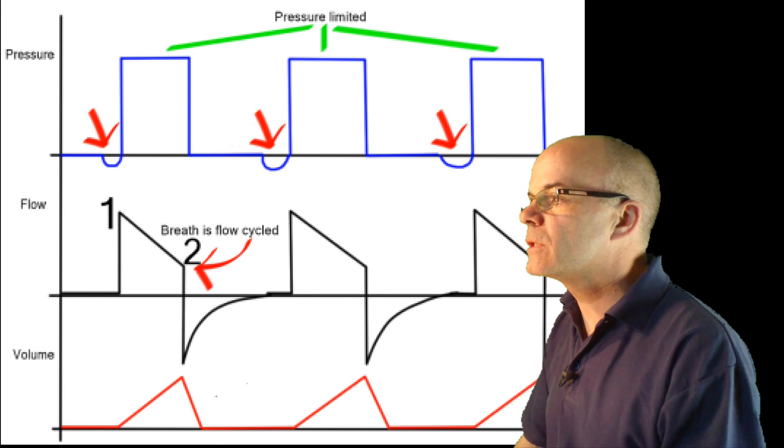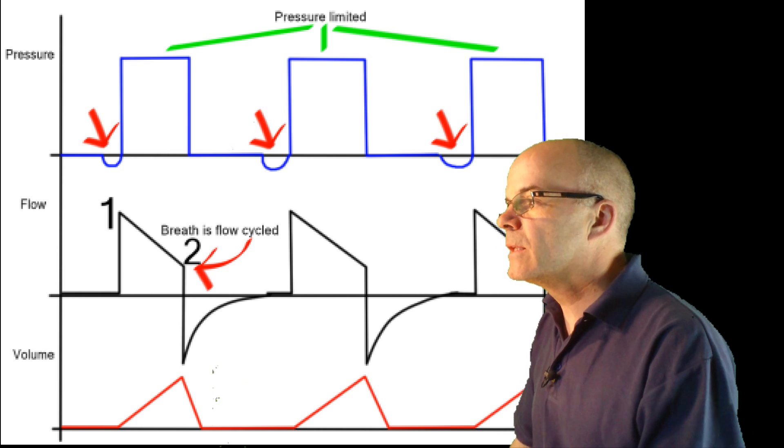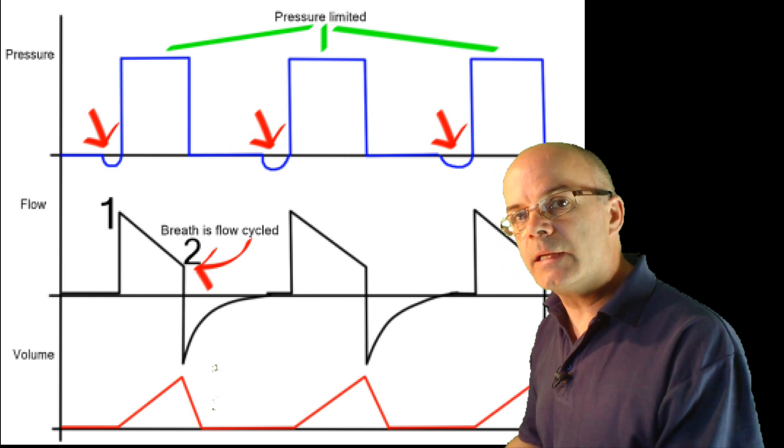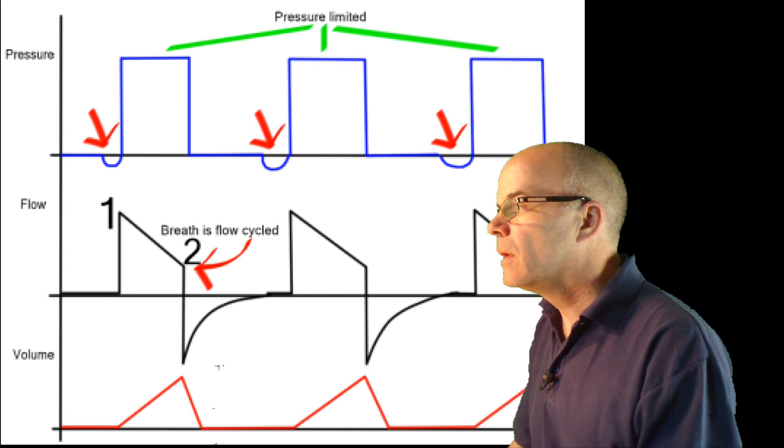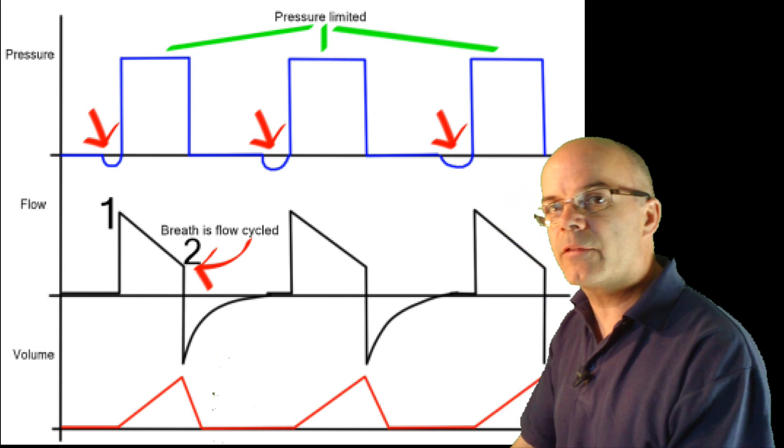There are a number of important points to note. If we look at the pressure graph, we can see a slight dip below the baseline before each breath, where each red line is pointing. This is the negative pressure created by the patient as they try to initiate a breath.